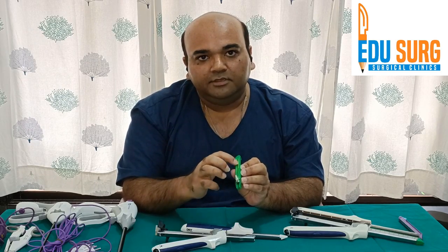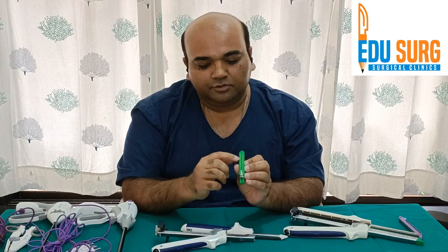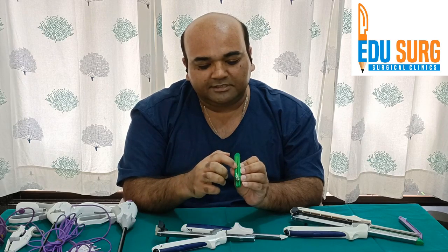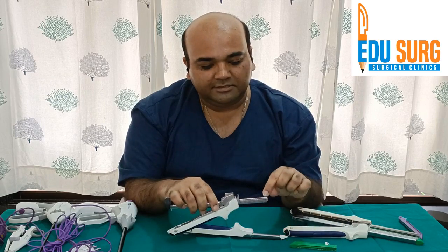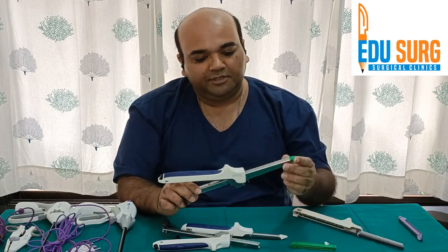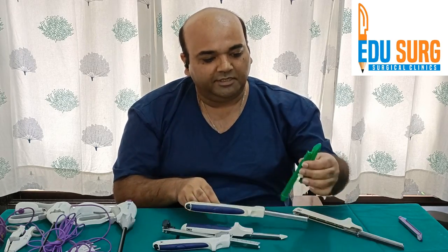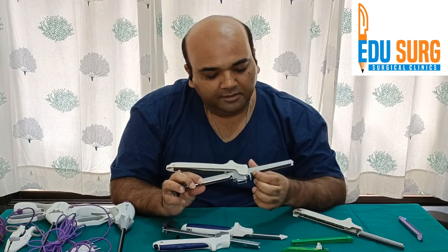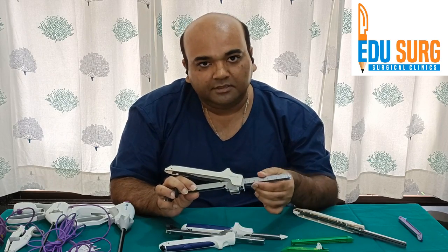This middle line is for the cutter — 2 rows on the inside of the anastomosis and this is the line where it will cut. The size of the staple is bigger in the larger cartridge. This is a 10 centimeter cartridge — we call it 100 — and this smaller one is 60.